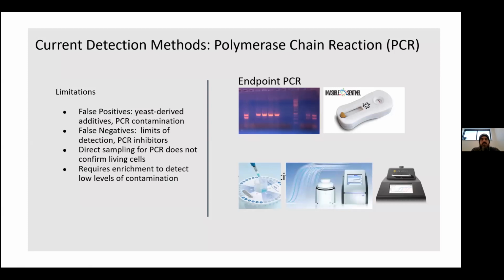The current genetic methods that are used to detect diastaticus have some limitations. You can get false positives. We have a really good story around false positives. We had a customer that would buy smaller pitches and then prop those up until they got to 100-barrel pitchable. And this is a brewery sophisticated enough to test everything that's incoming. So they would test the cultures we provided them.